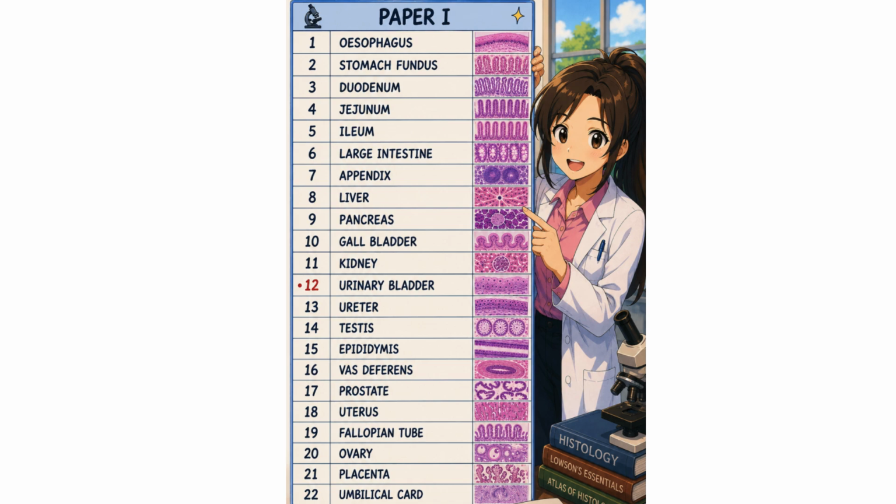Coming to fallopian tube, highly folded branching mucosal folds are the key feature. Simple columnar epithelium with ciliated and non-ciliated cells, which are called secretory cells, also called peg cells. Thin muscularis compared to uterus. Coming to ovary, you have outer cortex and inner medulla.